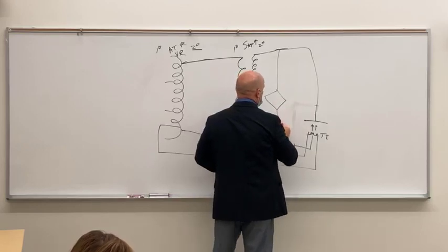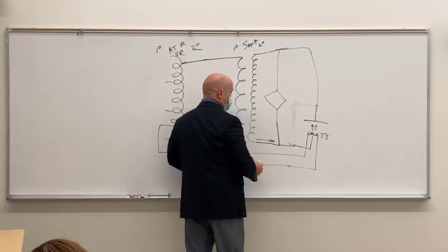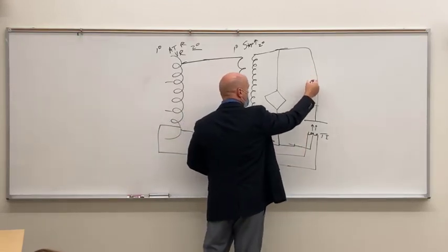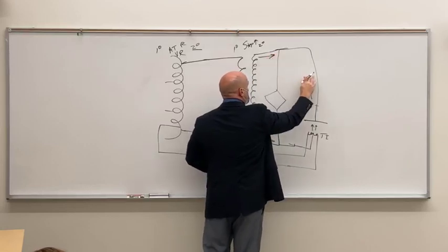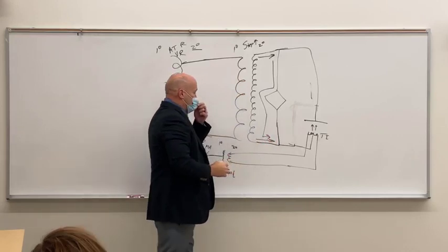Four. We're going to have 4 rectifiers, and what that does is it takes the electrons that normally go in that direction, but whenever they try to come back in the opposite direction, they're going to feed back down. We're going to have 2 pulses in the same direction.